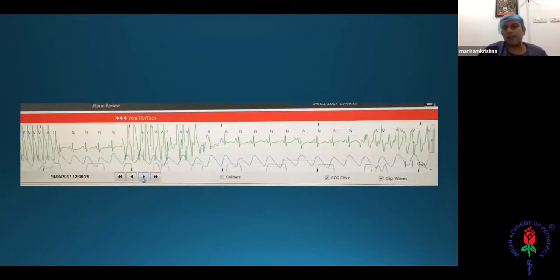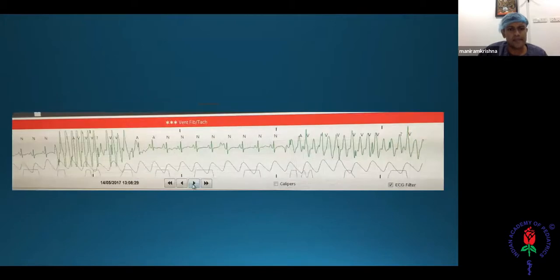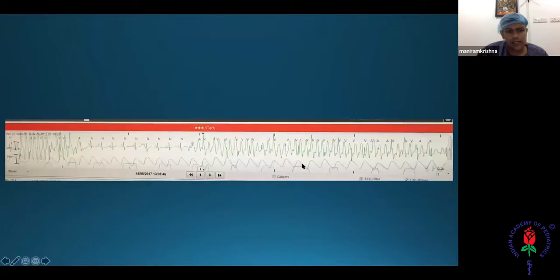And then suddenly it gets better all of a sudden. And then he's in normal rhythm for a short while. He goes back into the abnormal rhythm again and then comes back to normal, which is pretty bizarre. And it's not one time, you know, it keeps happening again and again and again. And here you can see a pretty long episode, which I can very well understand scared the daylights out of the pediatric resident, which is what prompted the call to me.